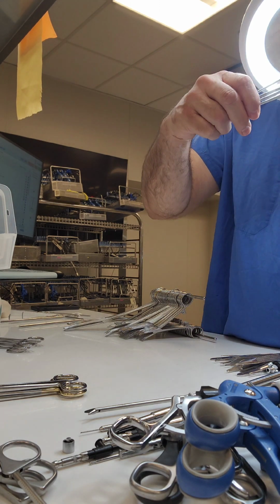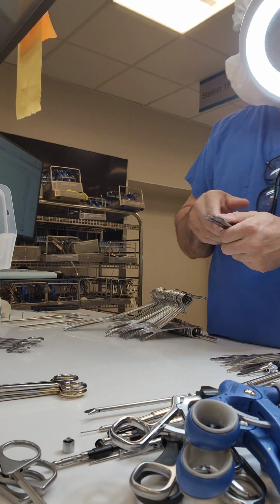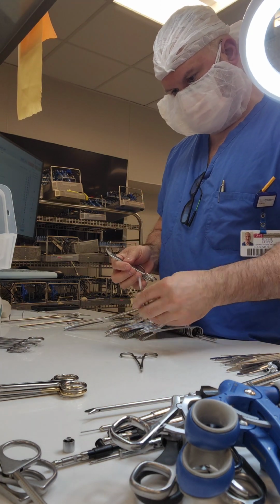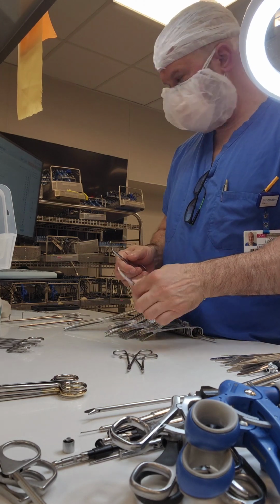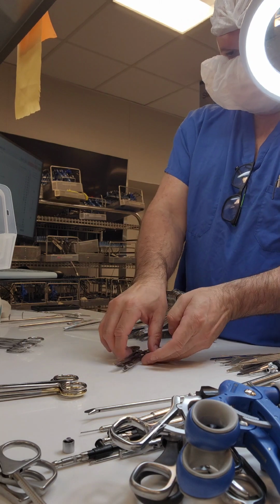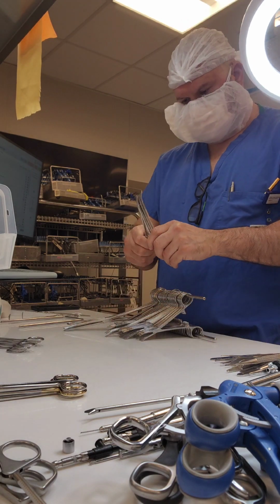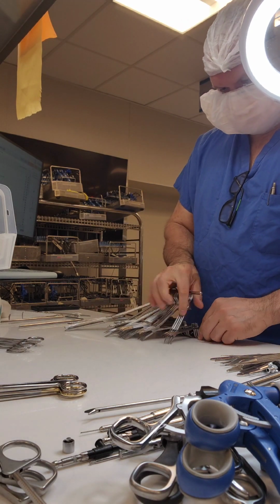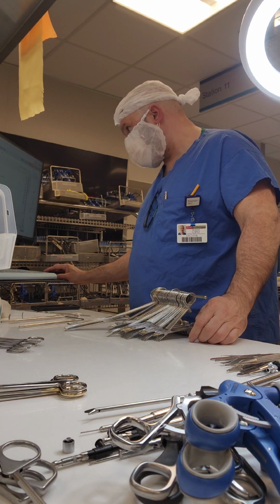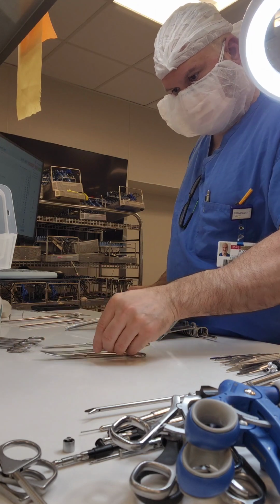Inspect, use your lighted magnification to make sure that you're not missing something that you can't see with the naked eye. Okay, when you tap test, you have to close the instruments to do that. Then you have to reopen the instruments to put on a stringer. And you see, it doesn't take long to do the tap test, right? But what does your policy and procedure say? Do you tap test every single instrument, or only do it randomly?